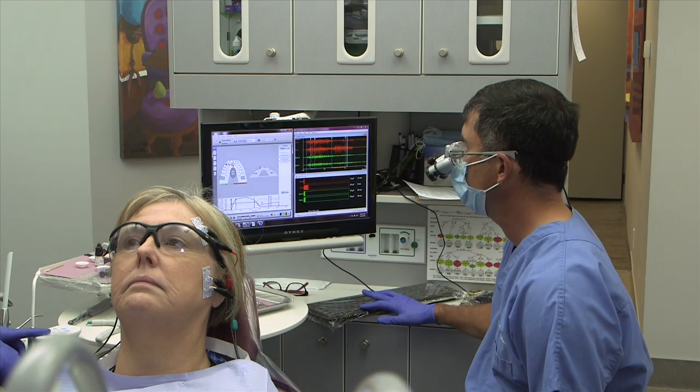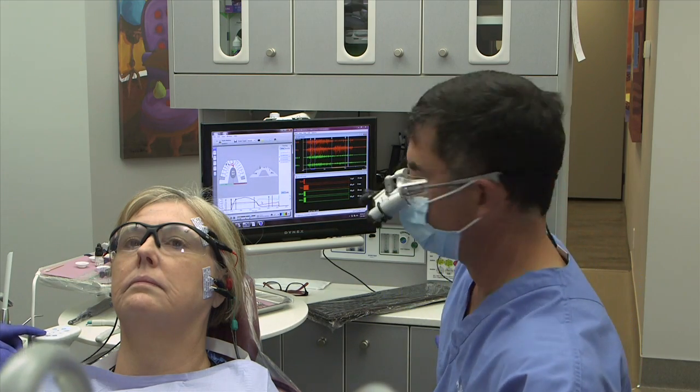What else is interesting is that before I started using EMG with the T-scan, I would have good results, but not amazing results. When you add EMG, you can prove that the muscle is shut down. So my advice to the patient looking for a dentist who does DTR: make sure they're using EMG. I mean, that's a little harsh, but if you want to be in the A range, you need the EMG, in my opinion. No question. The T-scan alone is great, but spend the extra money and the extra knowledge, and learn how to use the link itself.